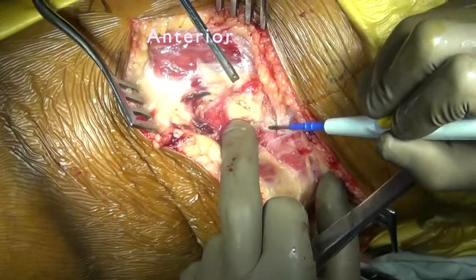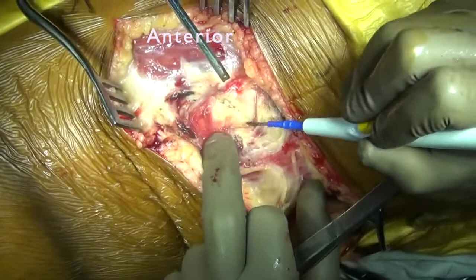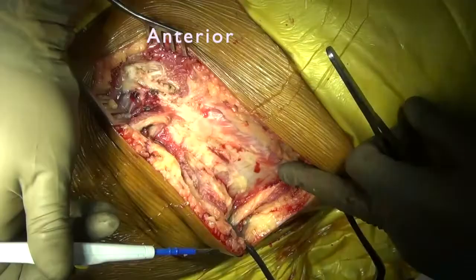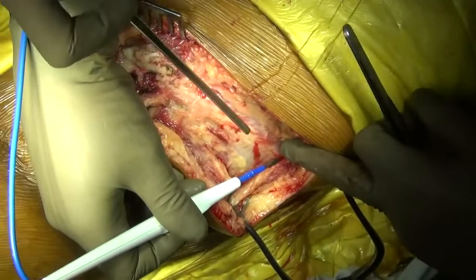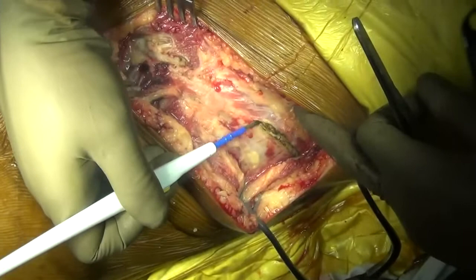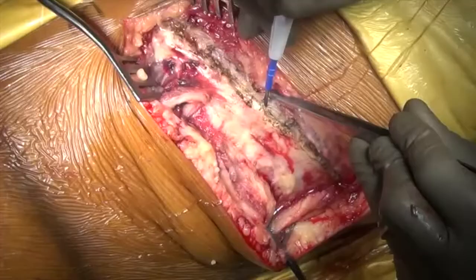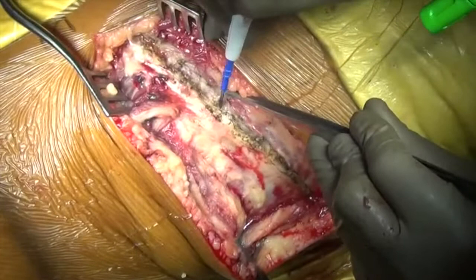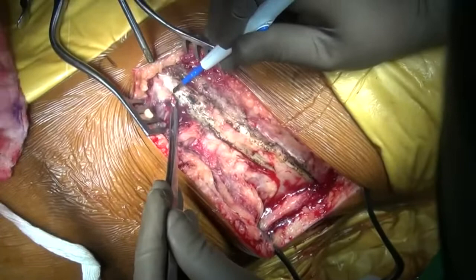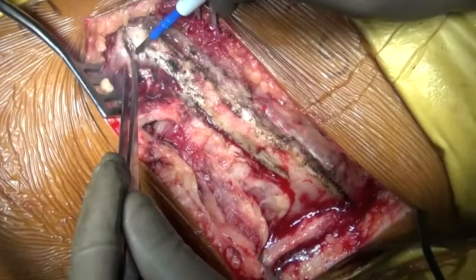This is extremely important — not only for the latissimus dorsi but other muscles as well — to achieve good suturing at end of surgery, otherwise these patients can develop weakness of the paraspinal muscles and chest wall muscles. After identifying the rib you want to excise, make sure you expose it posteriorly up to the angle of the rib and anteriorly up to the costal cartilage. This will give sufficient exposure into the cavity. Good dissection is of paramount importance to prevent injury to the neurovascular structures.